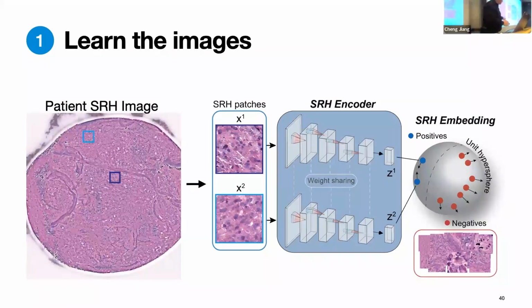So this figure looks very familiar, right? We'll use the same idea that we used earlier, where similar images should have similar learned representations, right? So we'll take the patches and we'll do either augmentations or we'll sample from patches that are from the same tumor class. And from here, we'll have the representations for the images.